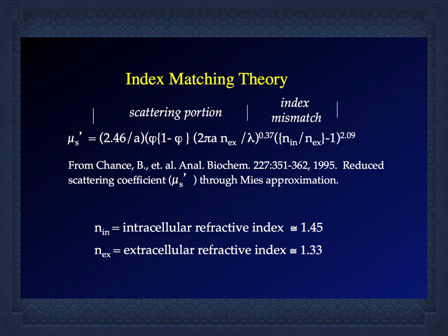I just want to point out that there are other parameters in this equation which are relevant. The wavelength you use absolutely determines scattering and what will scatter. And then the relative phase. If you have something like a clump of lipid, you're actually getting re-radiating from the molecules of lipid, and when they come out, their phases add up. There's a phase factor in here. So size of the scatterer plays an important role in shape along with the mismatch.